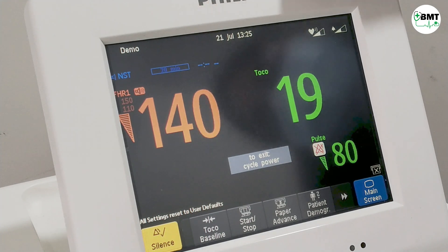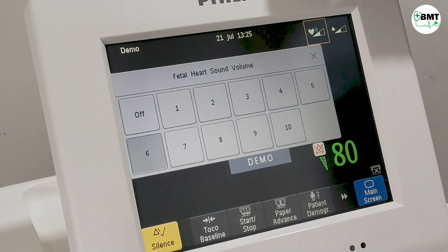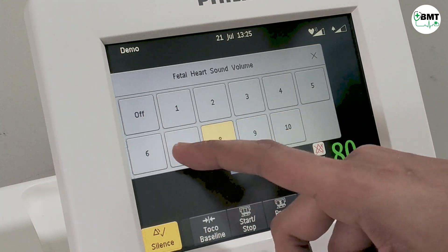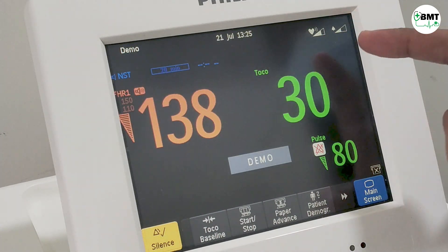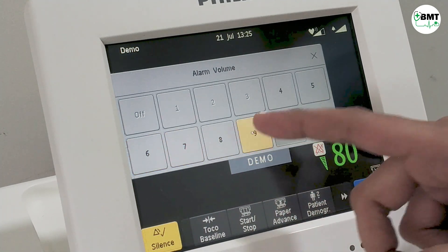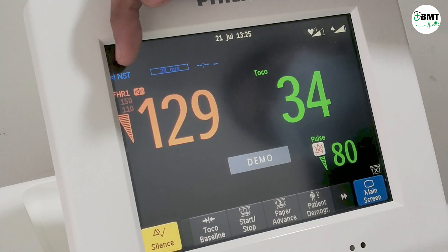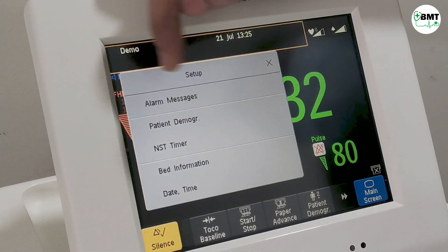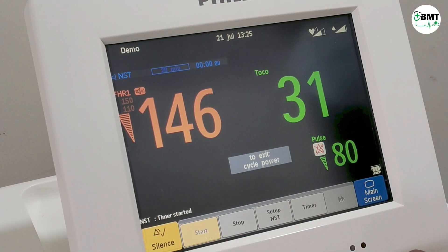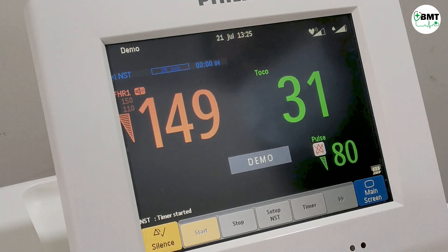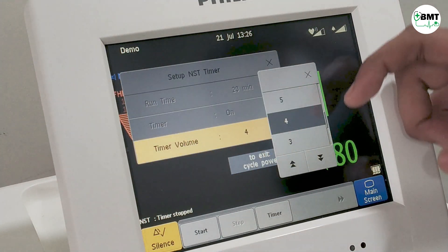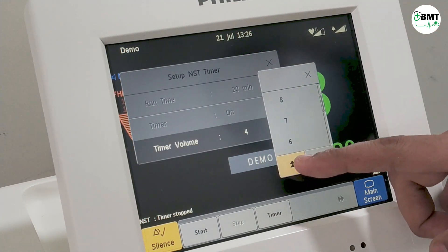This is the time and date display, and this is the sound of the fetal heart. You can increase the fetal heart rate volume up to 10. This is the alarm volume. This is the NST timer — you can start it by simply pressing start and the timer will begin. If you want to change the timer volume, it can be increased or decreased from here.